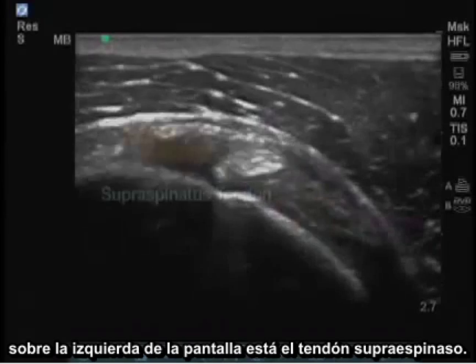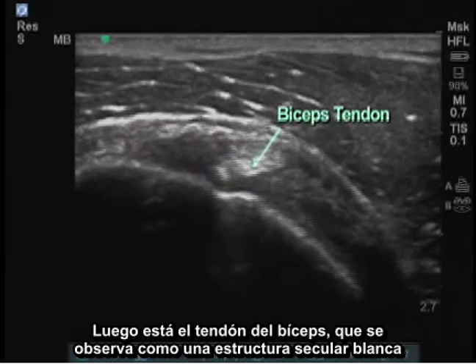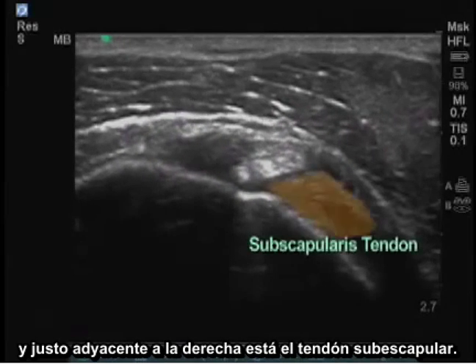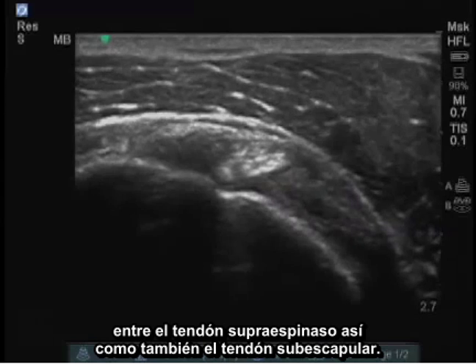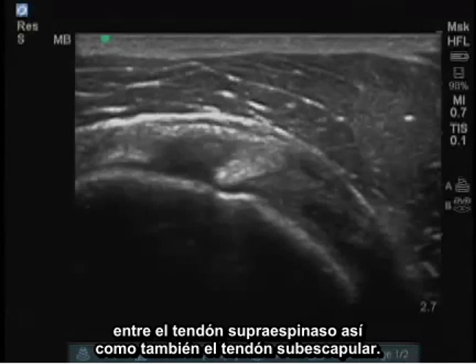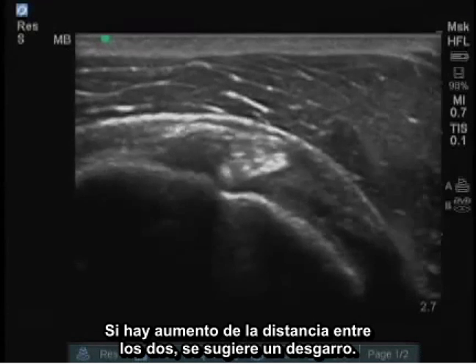On the left of the screen is the supraspinatus tendon. Next, there's the bicep tendon, which is the white circular structure seen, and just adjacent on the right to that is the subscapularis tendon. In patients with tears, we measure the interval between the supraspinatus tendon and the subscapularis tendon. If there's increased distance between the two, it's suggestive of a tear.